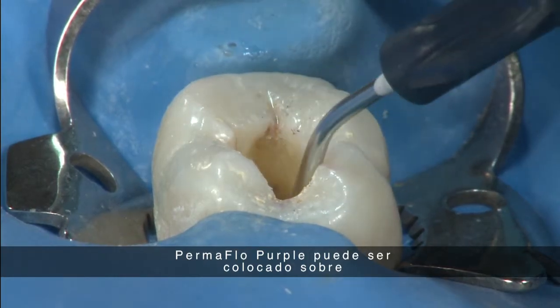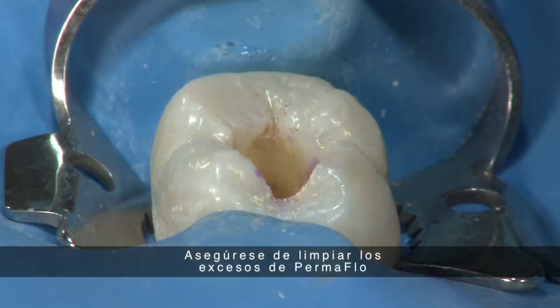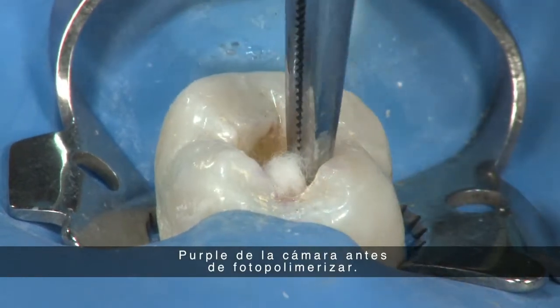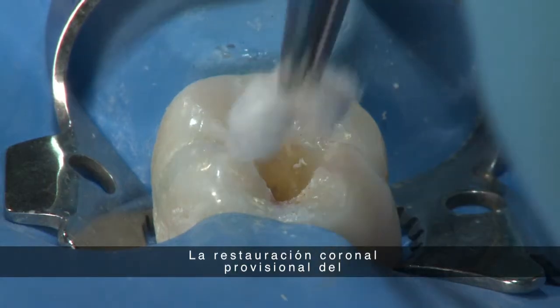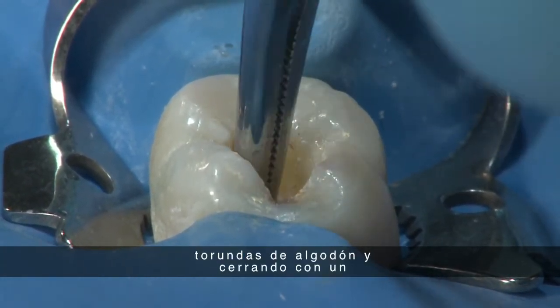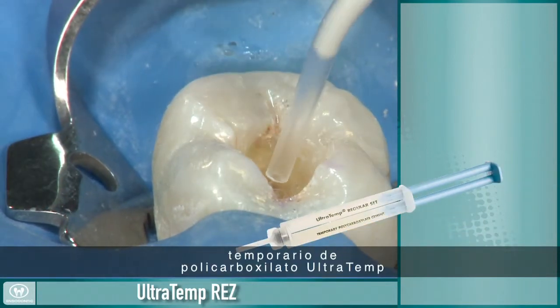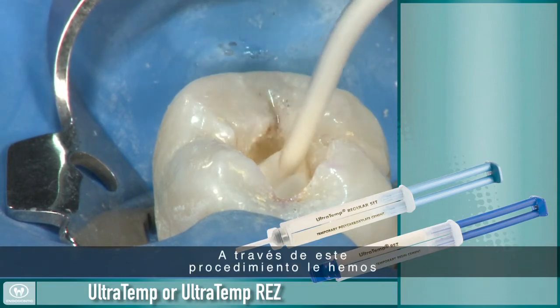Permaflo Purple can then be placed over each orifice of the entire pulpal floor. Be sure to clean excess Permaflo Purple from the chamber prior to light curing. Additional flowable or resin-modified glass ionomer may be placed. Temporization of the coronal aspect of the tooth can then be achieved by placing cotton pellets and closing with a firm temporary cement such as Ultratemp polycarboxylate temporary cement or Ultratemp-REZ.